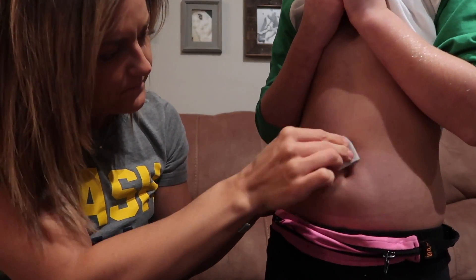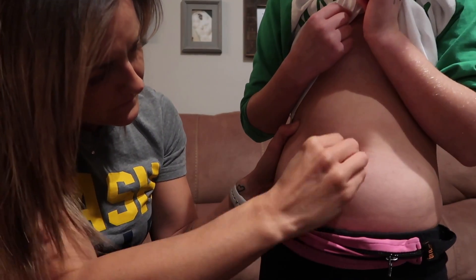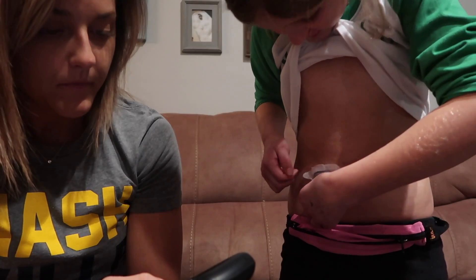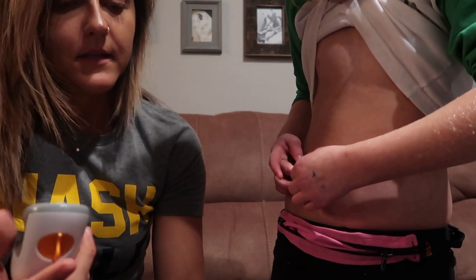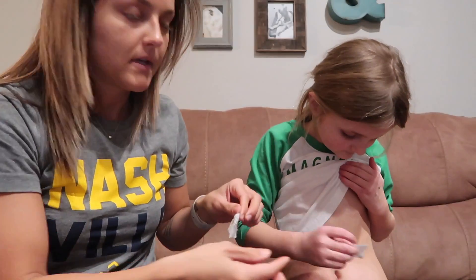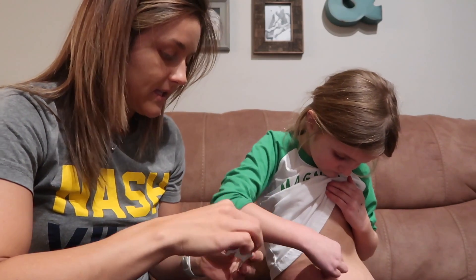Did you pour the juice on it? Getting the Dexcom out. She's got a little sore right here — I don't know if you can see it. So we're going to clean that. I'm going to get another Unisolve and clean that other side, okay?